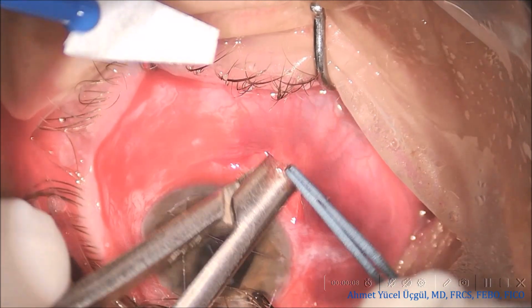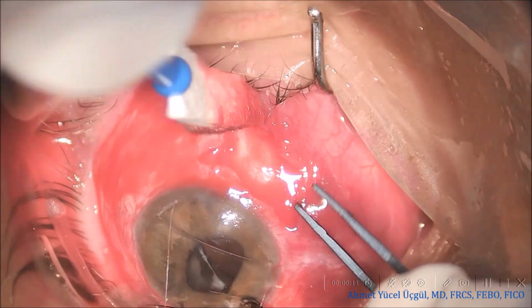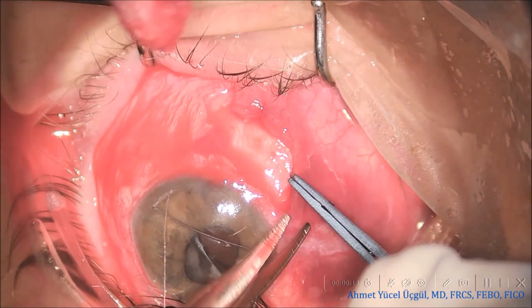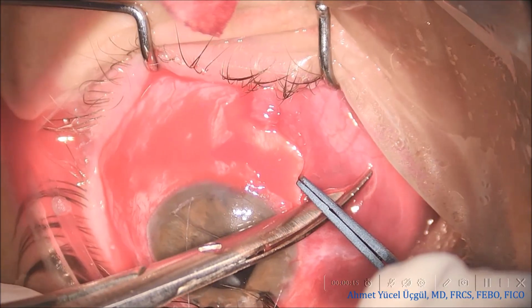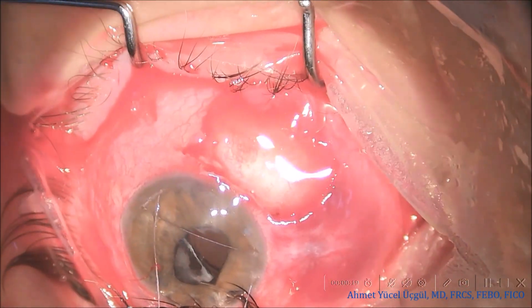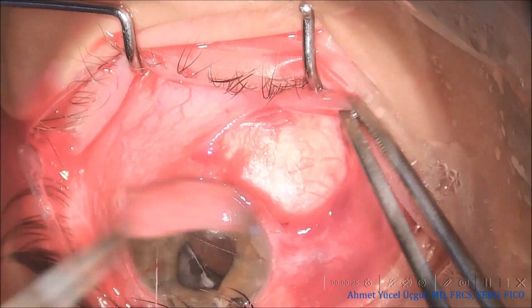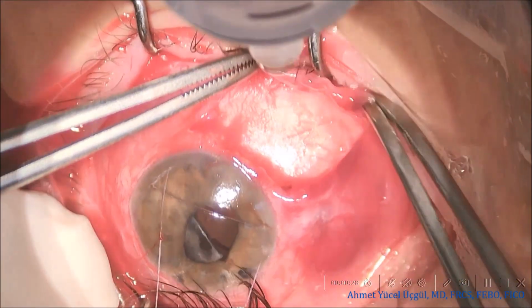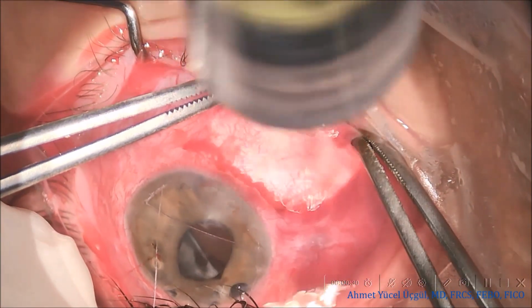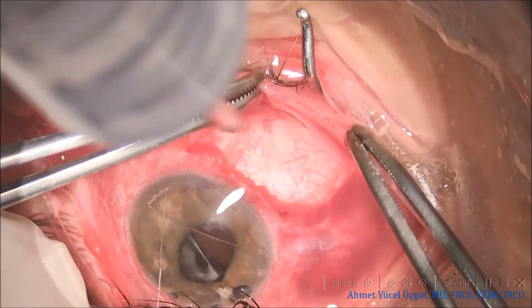Here, the inferonasal conjunctiva and Tenon are dissected to expose the bare scleral surface. The inferonasal bed is then prepared with Westcott scissors. Because the Ahmed plate is relatively small, further widening with Stevens scissors is generally not necessary. Similar to the previous Paul implant case, standard dose mitomycin C is applied using sponge pieces with a 3-minute exposure time and is followed by thorough irrigation with balanced salt solution.